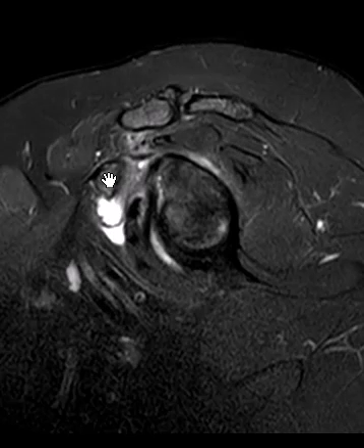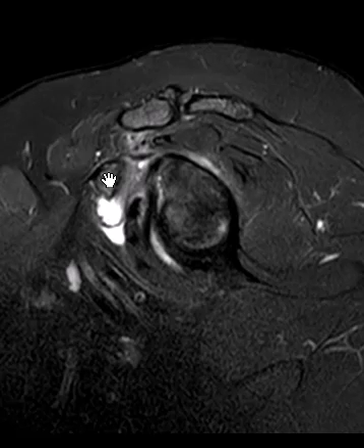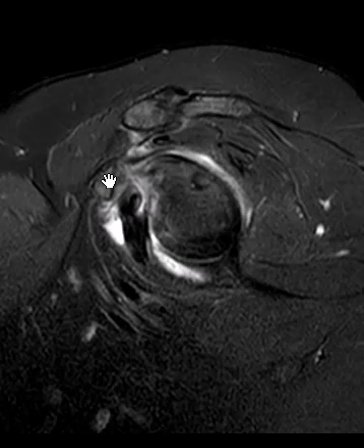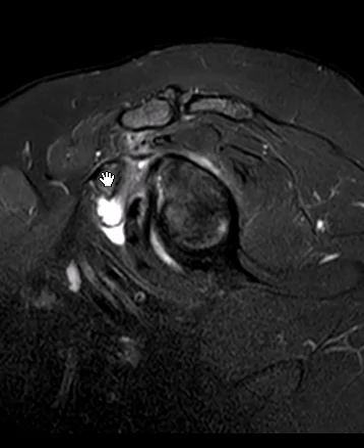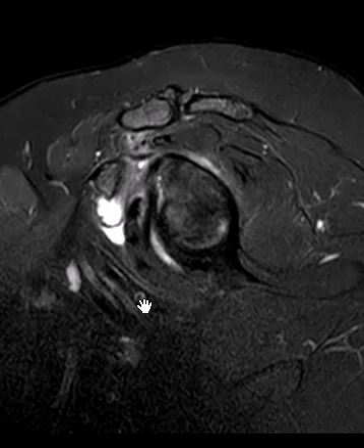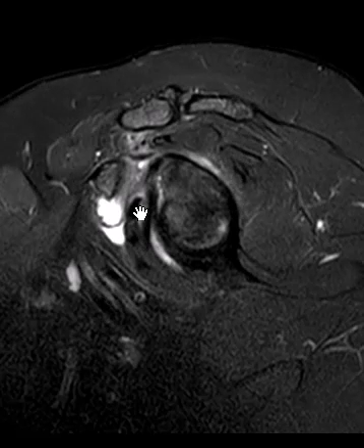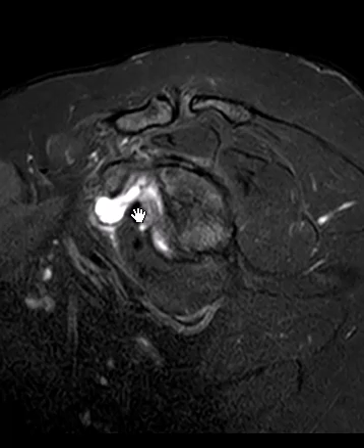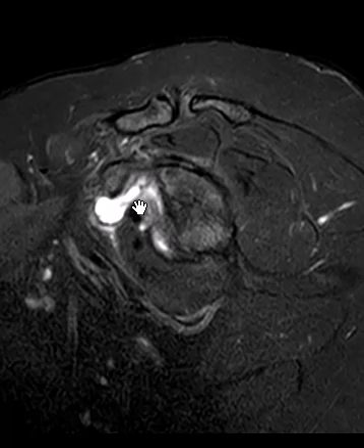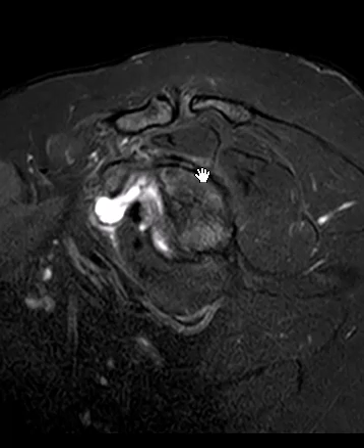I said that sometimes it can be hard to tell that fluid apart from fluid in the superior subscapularis recess. So in the prior case it was fluid here beneath the coracoid process and went down here in front of the subscapularis. Here's the subscapularis muscle and tendon, and the other fluid collection called the superior subscapularis recess — fluid within the joint.